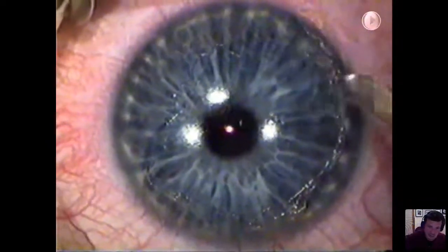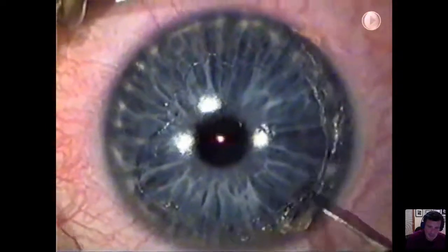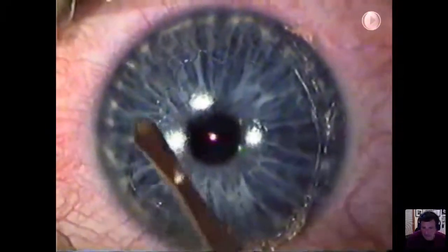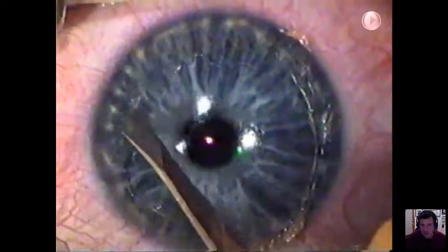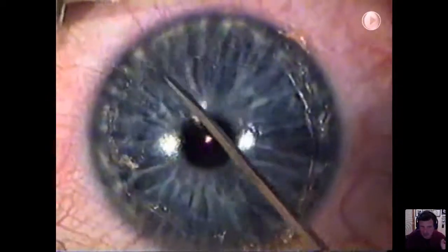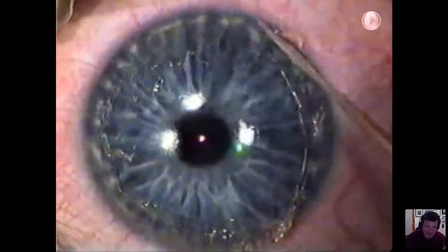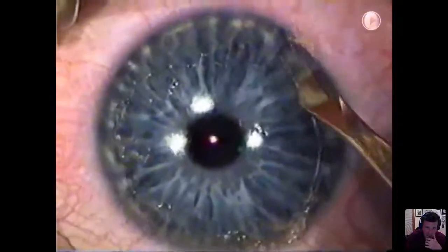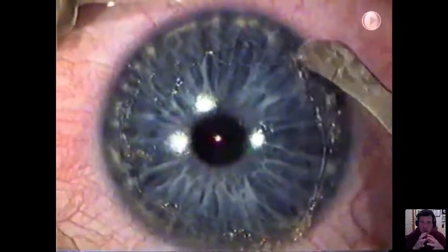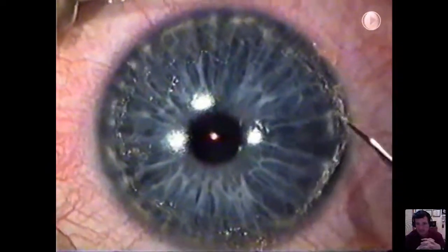You can see how diseased that epithelium is and why, with that eyelid and that epithelium, it becomes a recurrent corneal erosion. That's why I wanted to show you that video before, someone going for PRK that doesn't have EBMD, and this is a patient that has a recurrent corneal erosion. And what we're doing with the amniotic membrane is healing that basement membrane.